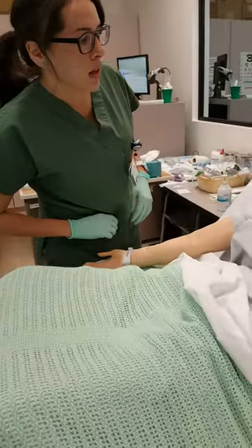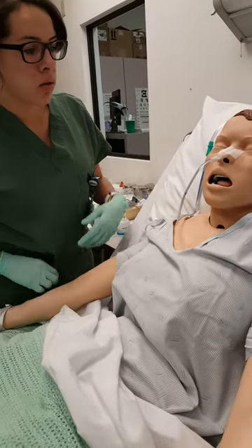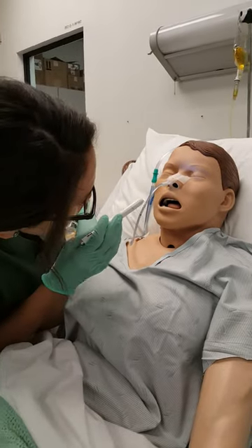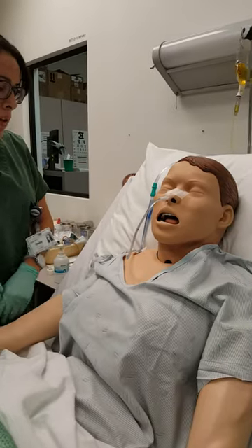So I'm just gonna make sure that it's in the right location, and the marking is right where it was before, and I'm just gonna check the surrounding skin. Does it hurt or anything? No. That's good.